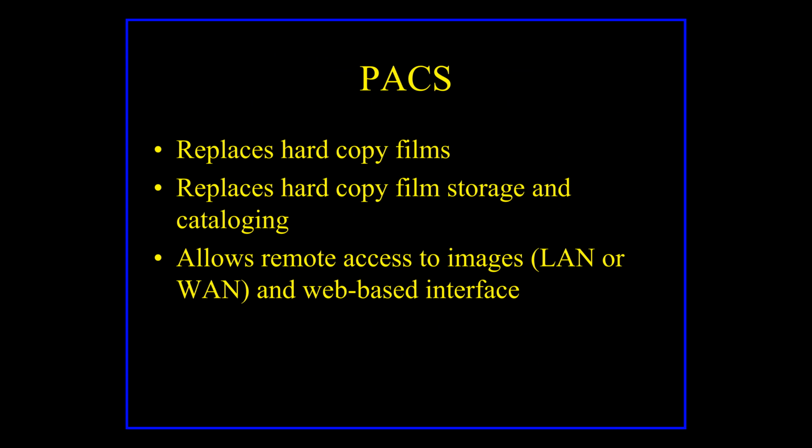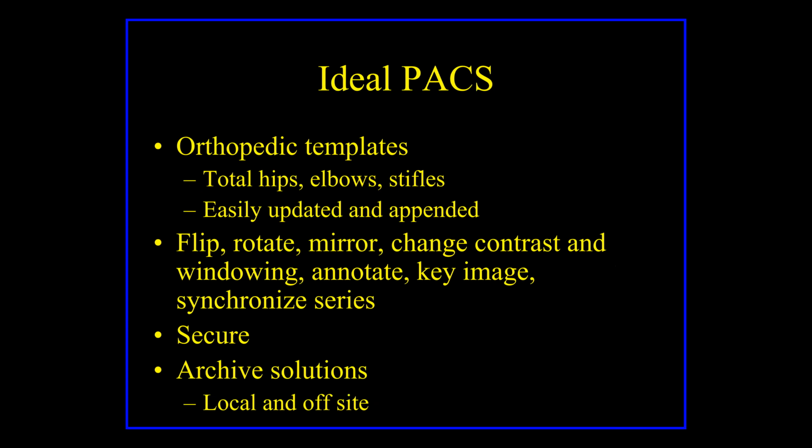It replaces hard copy films. It's a software system that catalogs and allows you to retrieve and look at different medical images from a patient. All of the software now is going to come with PACS. And again, there are good PACS systems, and there are some that are basically a picture viewer where you can look at x-rays but they won't show ultrasound at all. They won't show any video clips with ultrasound. They won't know how to do it.